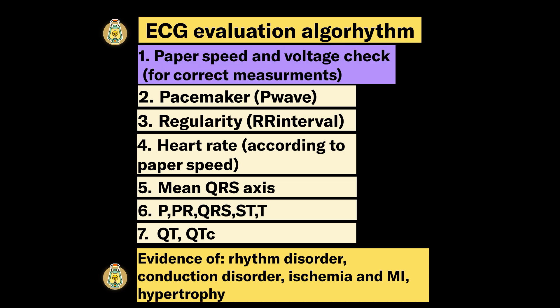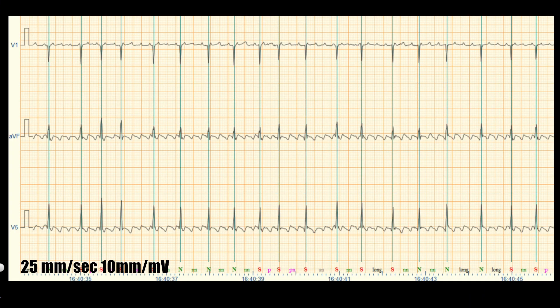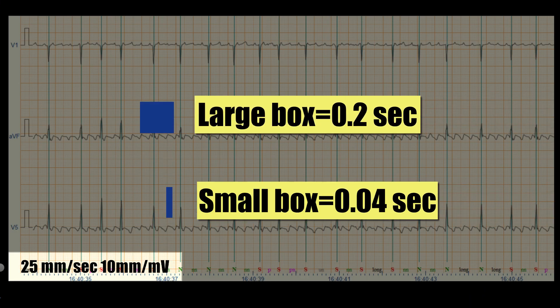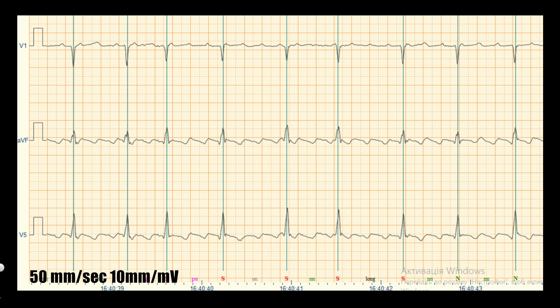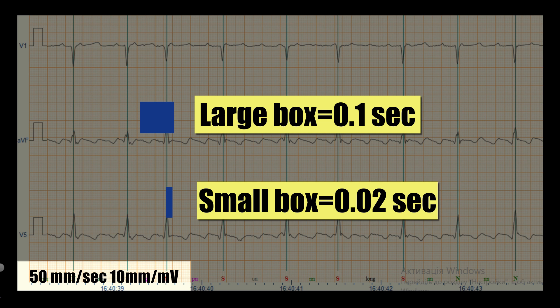We begin with paper speed and voltage check. In the case of 25 mm per second paper speed, one large box is 0.2 seconds and one small box is 0.04 seconds. This is how the same ECG looks at 50 mm per second paper speed, where one large box is 0.1 seconds and one small box is 0.02 seconds.